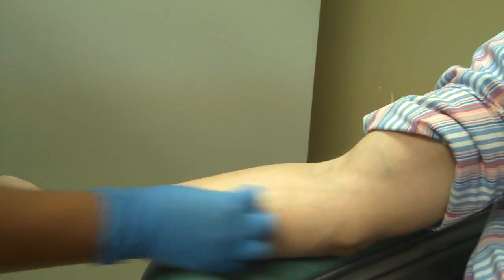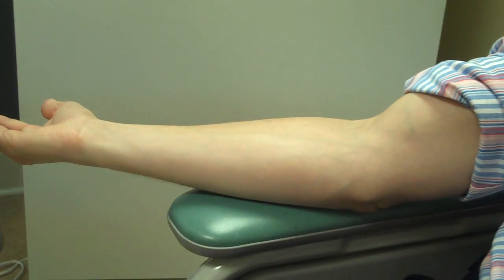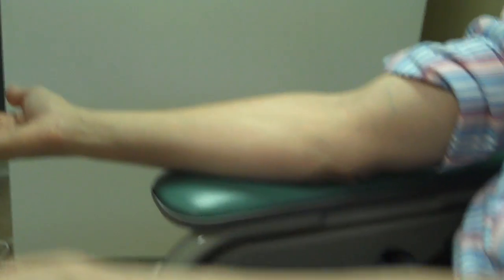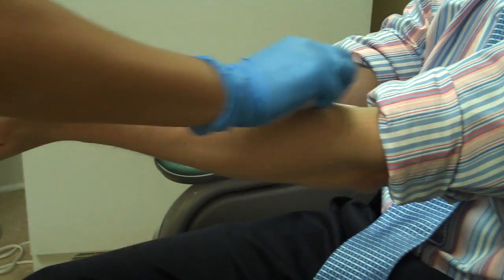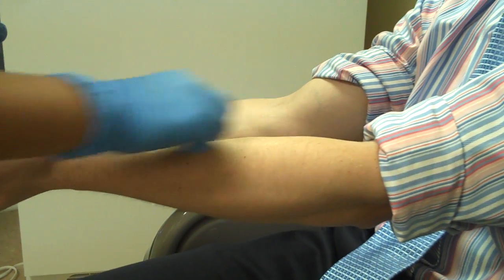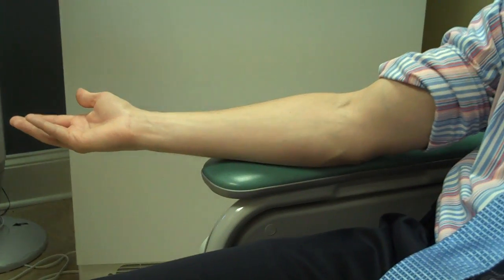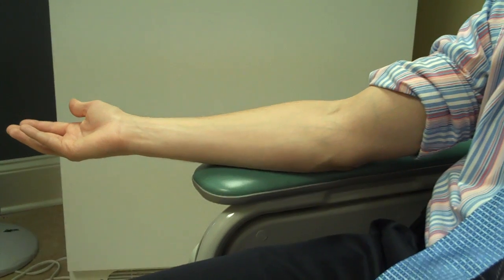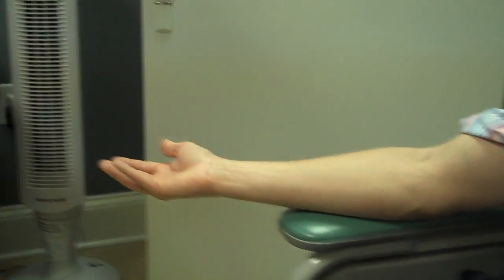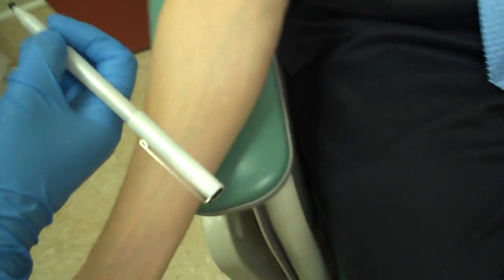We are going to be testing this morning for 40 different types of allergens, and that would include trees, grasses, dust mites, cats, dogs, and mold. The type of reaction we're looking for is going to be a mosquito bite reaction — that's an indication that the test is positive. If we don't get any type of raised skin, the test will be negative.